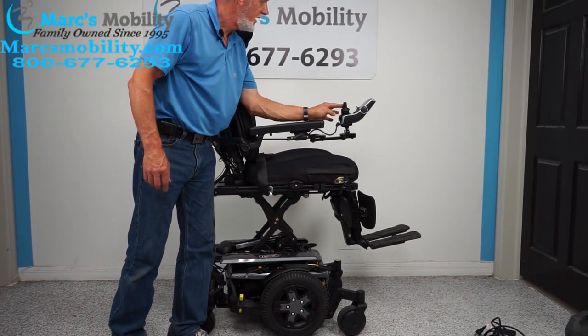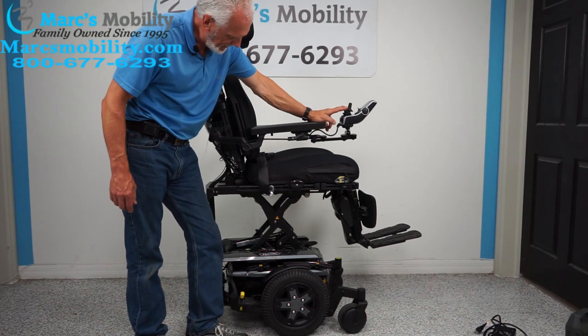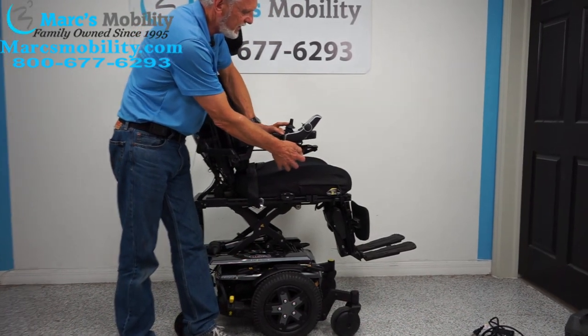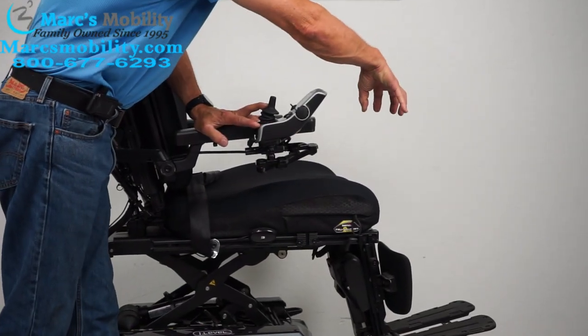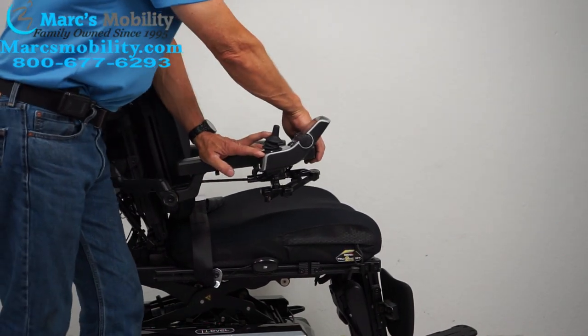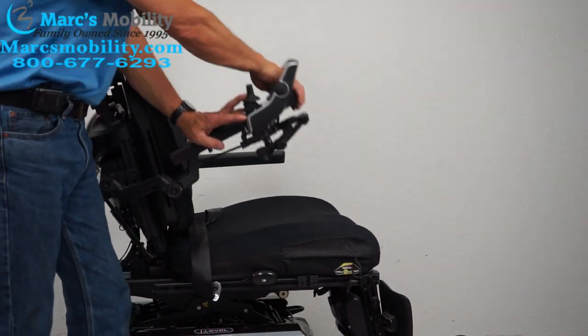By the way, when the seat's elevated, you can drive at 3 to 4 miles an hour. As I bring the seat down, let me show you the swing-away joystick. The joystick can be moved from one position to another — this gives you a lot more room to get close to a dining table without having to raise the whole arm up.